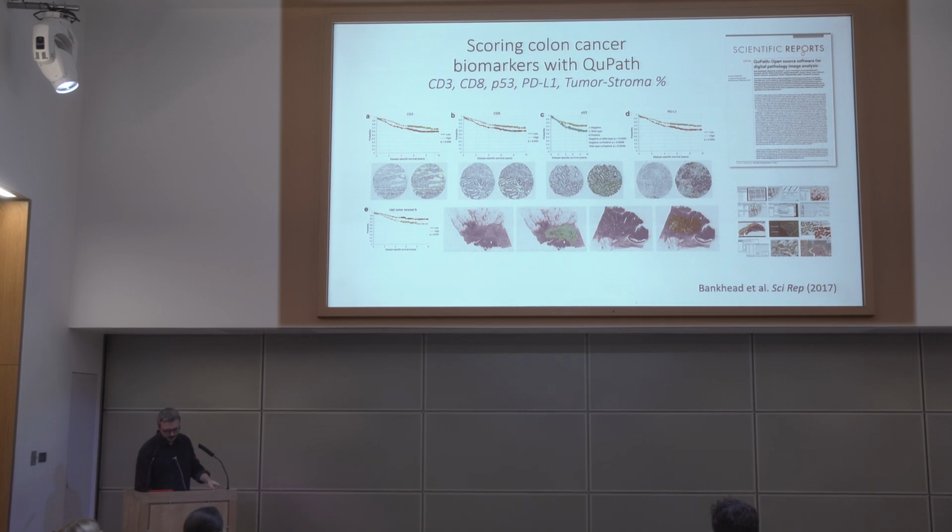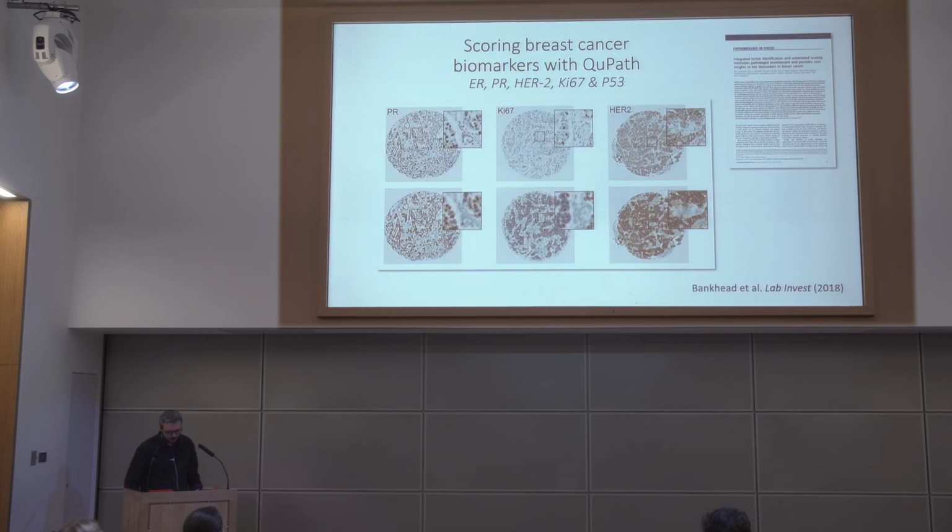You can adapt it to these different applications. A second publication from my time at Queen's was looking at breast cancer biomarkers. Again, it was still primarily focused on tissue microarrays because that's what I had mostly at the time. Looking at ER, PR, Ki67, HER2, and P53.